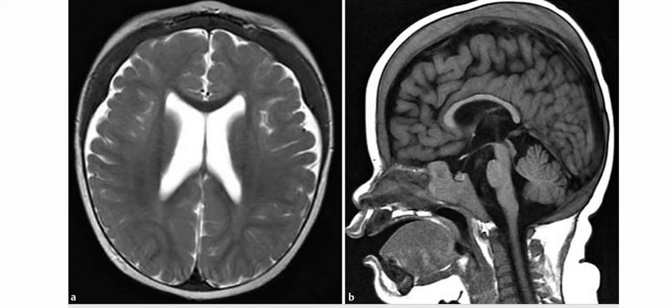These are images of a 2-year-old boy presenting with chronic illness and large head size. On the axial T2 MRI, there is symmetric enlargement of the parietal and frontal bones with decreased marrow signal intensity throughout. On the sagittal T1-weighted MRI as well, there is symmetric enlargement of the parietal and frontal bones with decreased marrow signal intensity throughout.